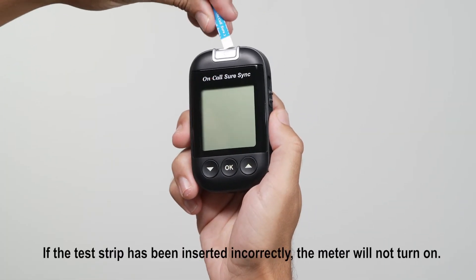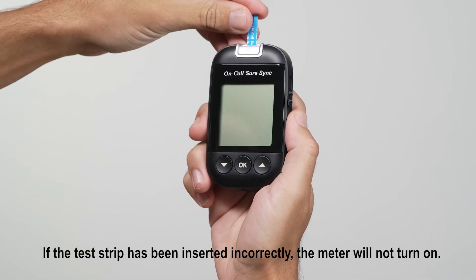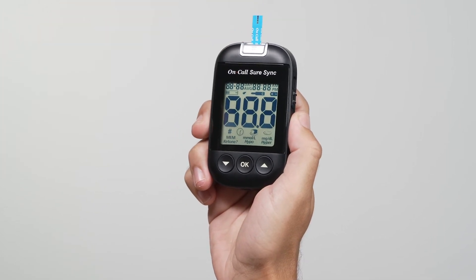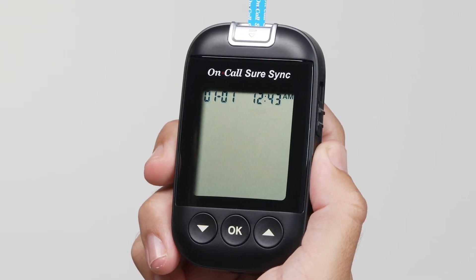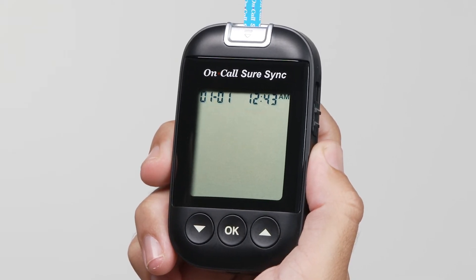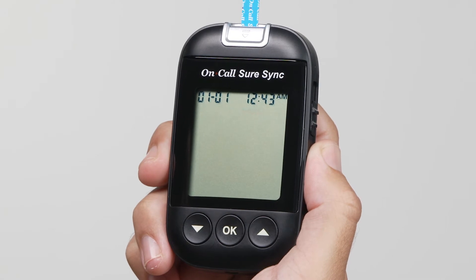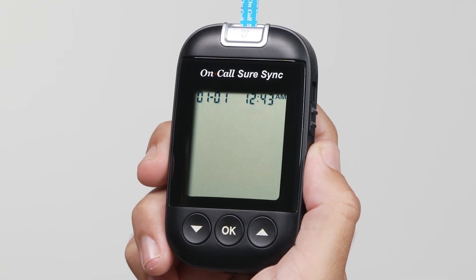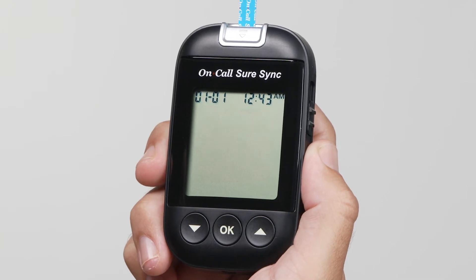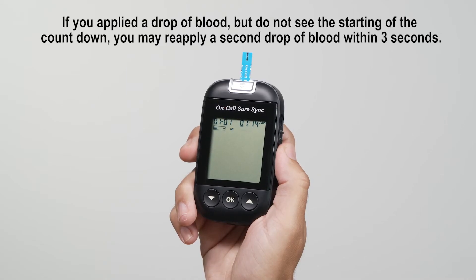Insert a test strip into the strip port, contact bars end first and facing up, to turn on the meter and display all display segments. Following this display check, the system will enter the test mode. The display will show the date and time, and the strip icon with the blood sample icon blinking to indicate that the test strip is inserted correctly and a drop of blood can be added. The meter is ready for testing when the blinking blood drop and strip symbol appears.